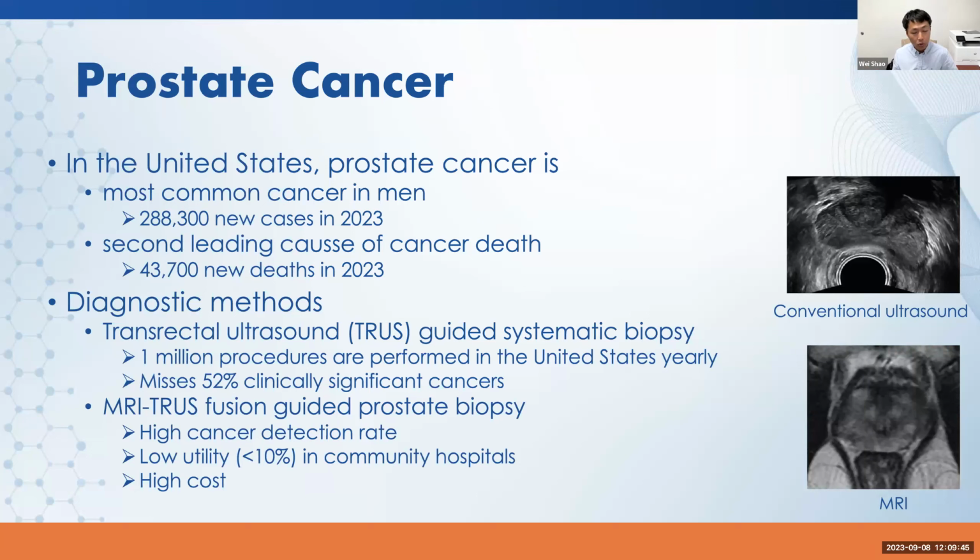So a better way to diagnose cancer is to have imaging to tell you where exactly those cancers are. This is called MRI-ultrasound fusion guided biopsy.